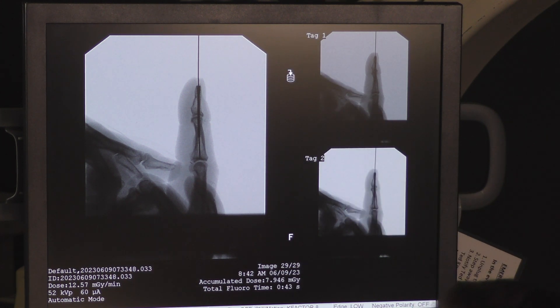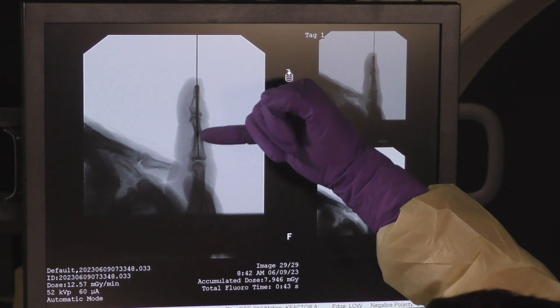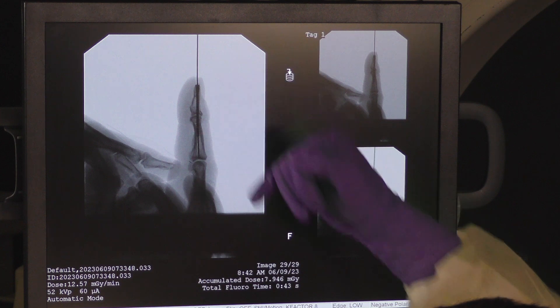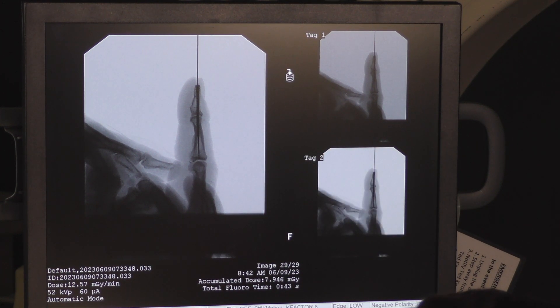You see good fill in the canal of the middle phalanx as well as good fill within the distal phalanx, so that way it'll be a nice robust fixation for this fusion.